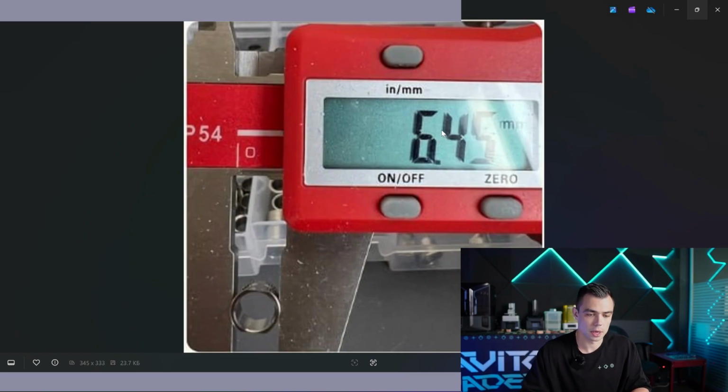When you see such an issue, that you have printed your surgical guide and it's not possible to insert the sleeves, you start to reprint everything, you start to change printer settings, you do some printing tests and so on, but the problem may not be in the printing, and not in the resin. Just check the size of the sleeves, because sometimes the manufacturer can cause you some issues. And again, I wish I knew it earlier.